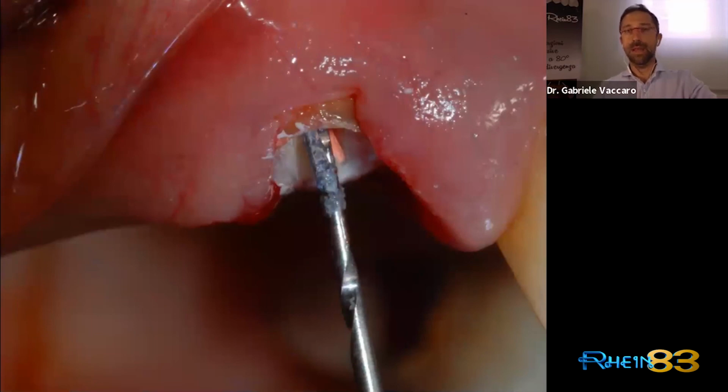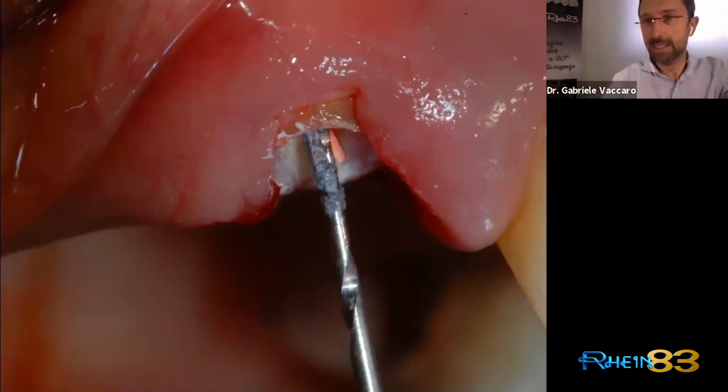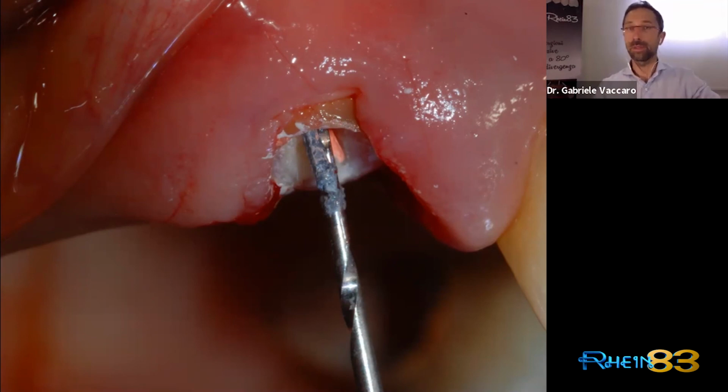After that, we have to create the post space to cement, to glue in our pivot. Since I use the Thermafil system, I need to use this kind of burr to remove the gutta-percha and the plastic carrier that is inside the root. If you use gutta-percha only, you can use the Gates file in exactly the same way.